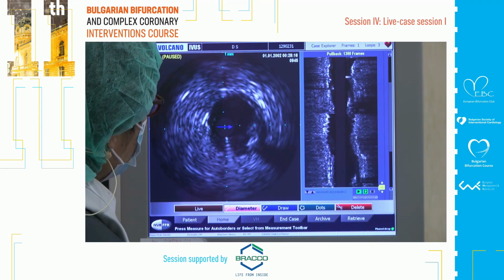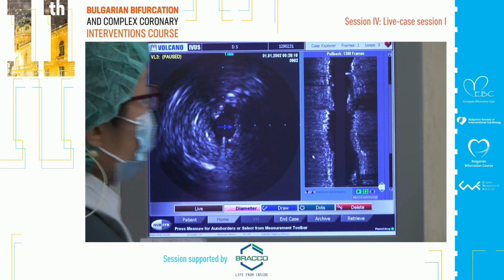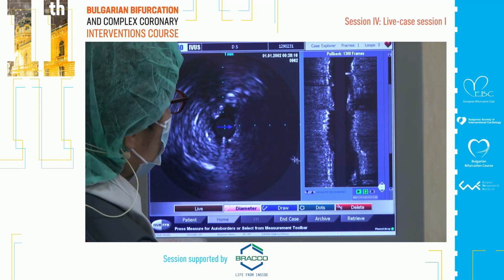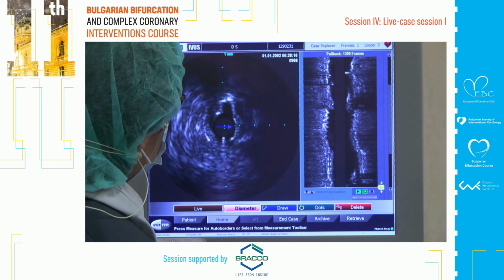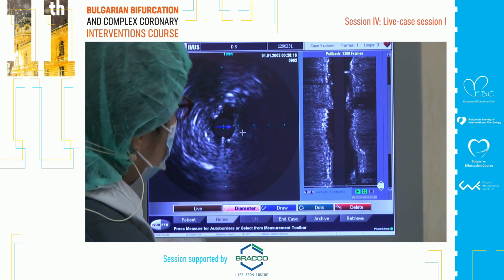And then where you got stuck with the catheter is here. This is the place where you got stuck. But actually, not too bad. You see the calcium is only here to here. It's only 180. So I don't think you need more rotablator, just making a good balloon, and this is okay. And that's the place you got stuck, right? Yeah. And then you polish the surface of the calcium and then make the lumen.